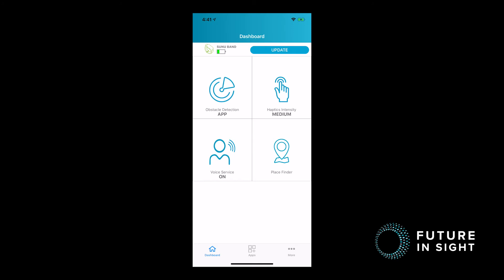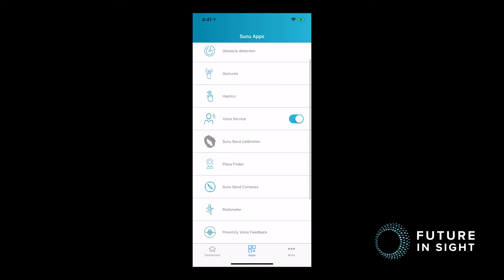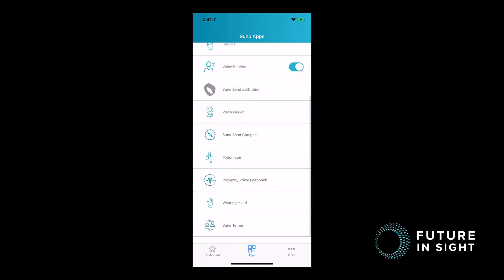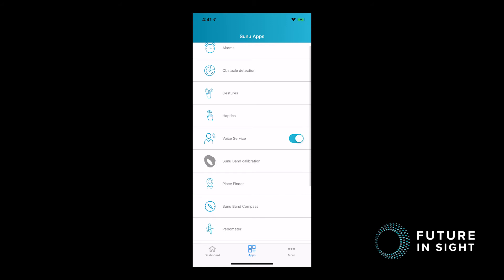Finally, the last thing I'd like to show you is the Apps tab at the bottom of the screen in the middle. If you tap on that, it brings you to more detailed areas where you can change the settings. It also has a pedometer so you can see how many steps, and it would also be where the Sunuband tethering is included. This is a great section to find those more detailed things that you might be looking for.